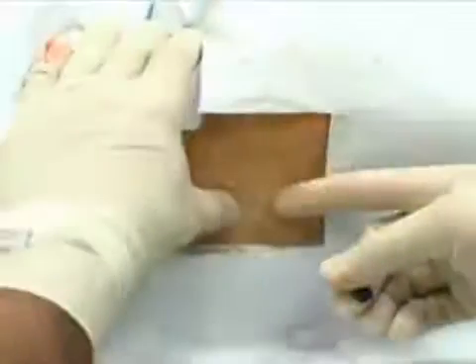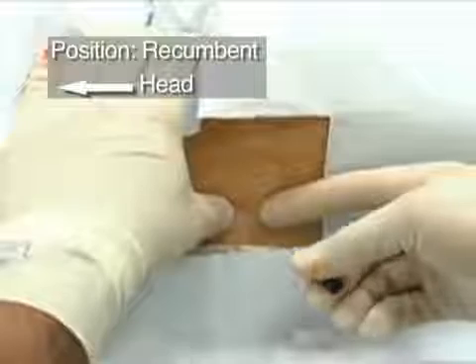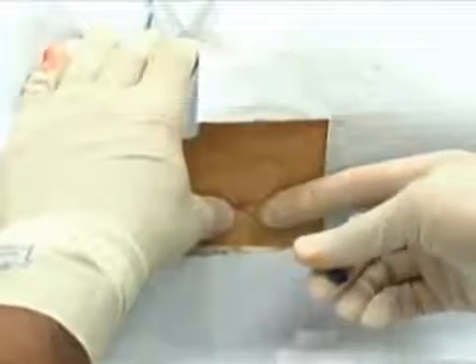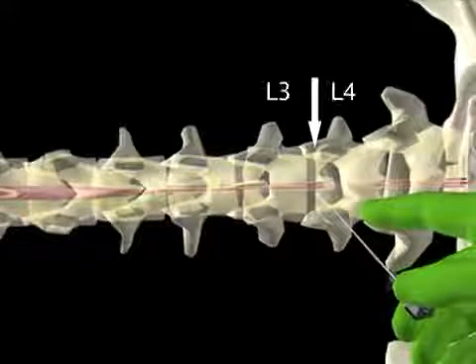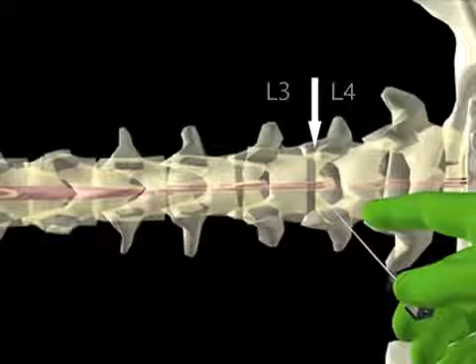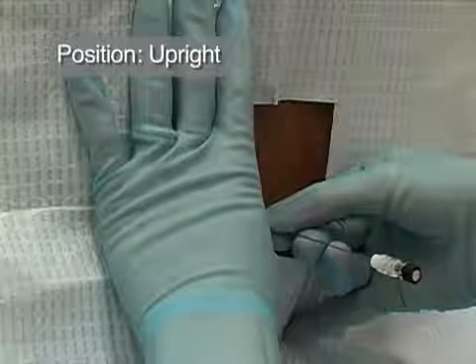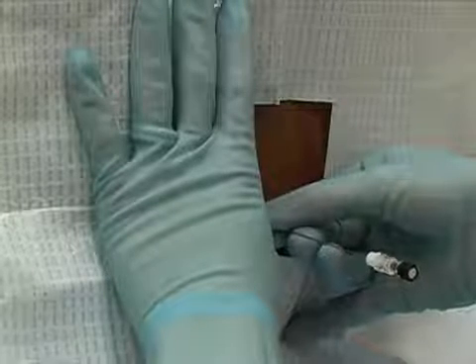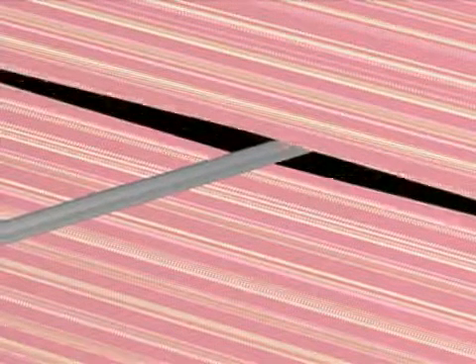Identify the anatomical landmarks once again and insert the needle with the stylet firmly in place, in the midline, at the superior aspect of the inferior spinous process, directing it at an angle of approximately 15 degrees, as if aiming at the patient's umbilicus. You can use a pencil tip needle, or ensure that the bevel of the needle is in the sagittal plane so as to spread rather than cut the fibers of the dural sac.